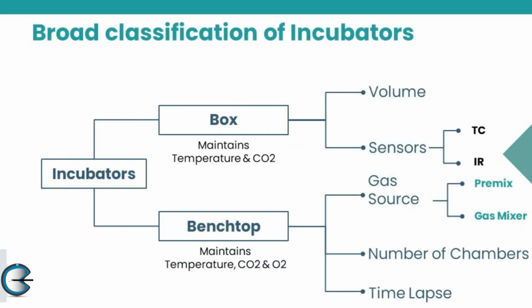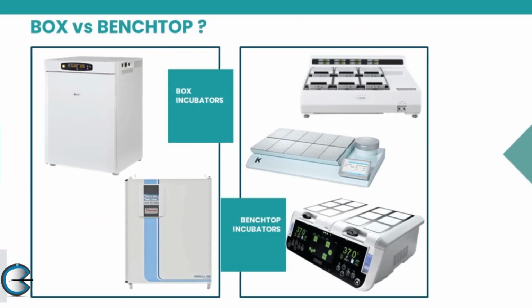Benchtop incubators can be roughly classified based on source of the gas, number of chambers, and presence or absence of a time-lapse. We will come to this later. So which one do you need? A box or a benchtop? If we are still debating this, then I think we are practicing wrong embryology.